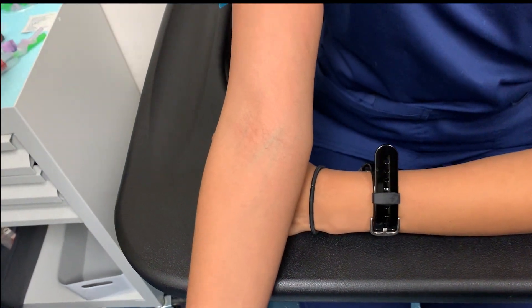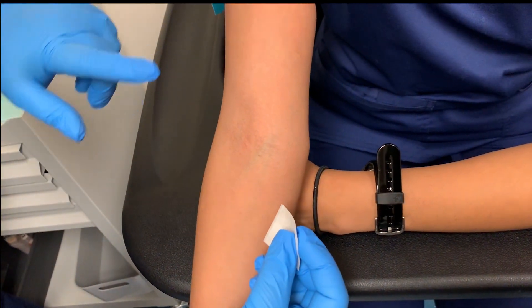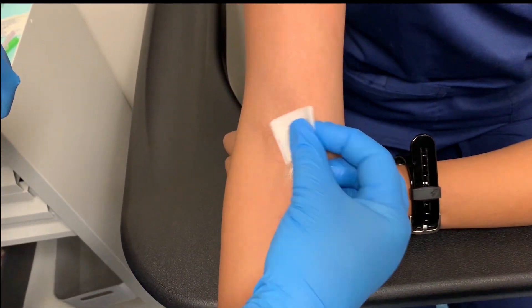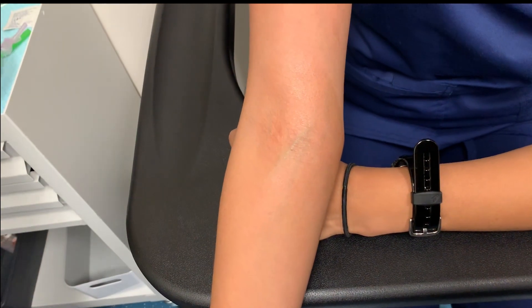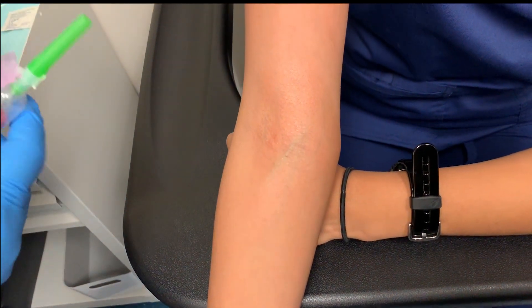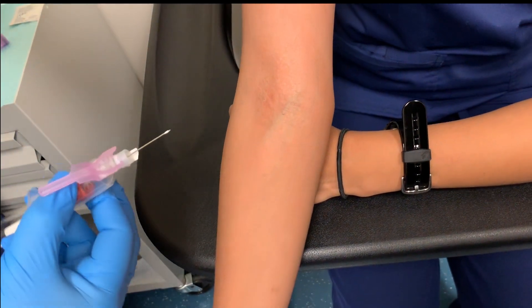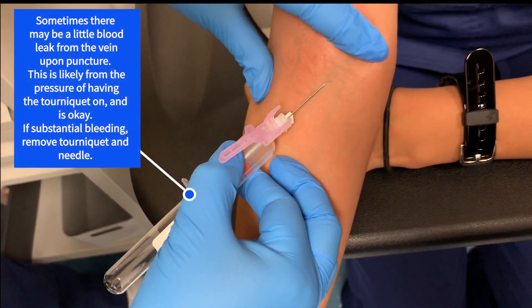The whole point is to make sure you do this pretty quickly. Once the tourniquet goes on, you want to make sure that it stays on for less than a minute. Take your alcohol pad and wipe from the center outward in a circle. Once you're done, you want to make sure that you anchor your vein so that it doesn't roll away.